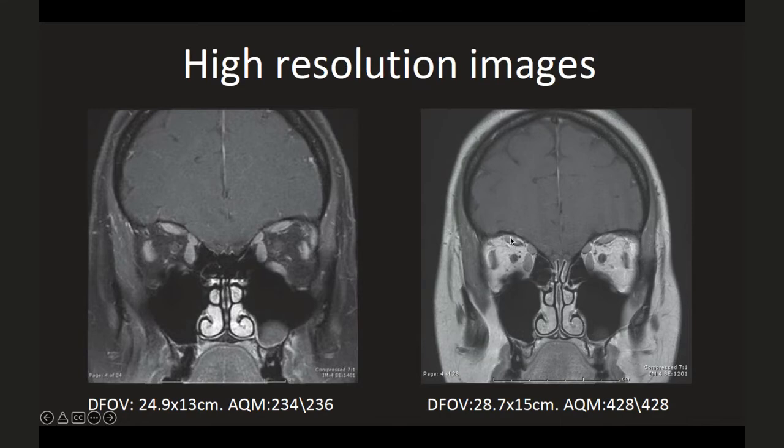And then again, the superior, medial, inferior, lateral rectus. Whenever you have air, sometimes you have some artifact going on nearby. And if there was a fracture and somebody had put in a metal or whatever, then I get a little bit more susceptibility artifact on one side than the other. Then you put on that small Sherlock Holmes hat and you see, but sometimes it's just air. And then you see the optic nerve. Optic nerves usually do not enhance. A little bit of enhancement can be associated with some of the vessels that supply it, nameless teeny tiny vessels.